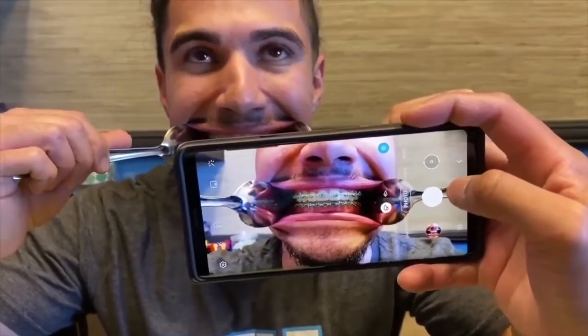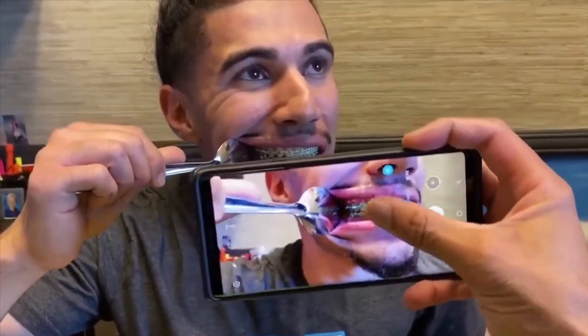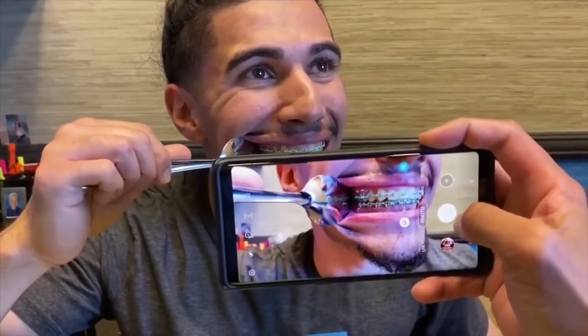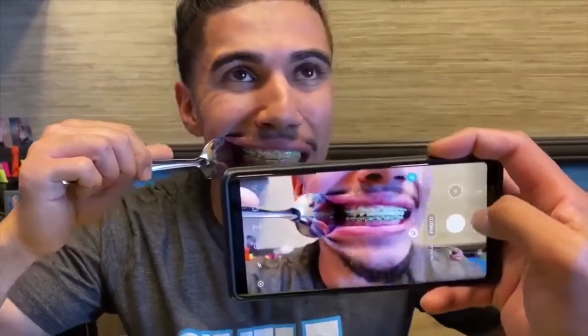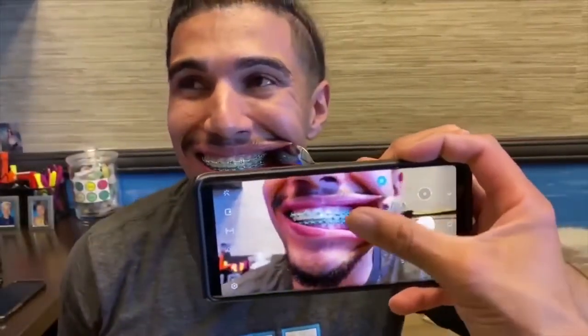Now the next photo, you're gonna take one spoon out and you're gonna turn away from your spoon, then bite down on all of your back teeth. That's teeth two. Then for the next photo — we'll call it teeth three — we're gonna do the exact same thing on the other side of your mouth.